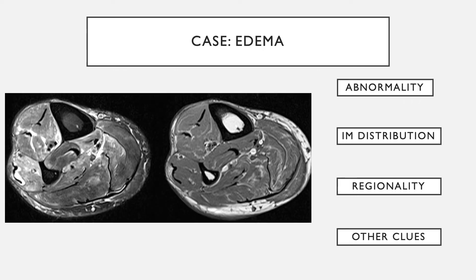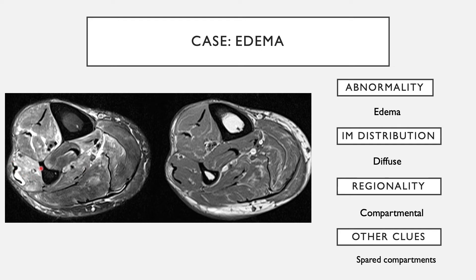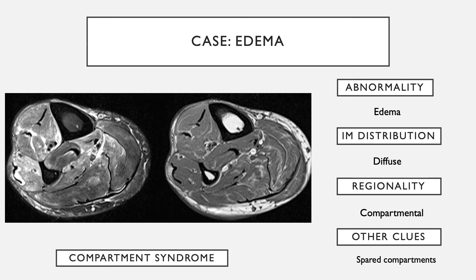In another case of edema, the intramuscular distribution is rather diffuse, with some peripheral intermuscular fluid and also diffuse edema within the muscles. The regionality is more compartmental — it is the anterior compartment that is really involved, while the posterior compartment is fairly minimal. The gastrocnemius compartment is also spared. With one compartment involved and other compartments less involved or spared, this is consistent with compartment syndrome.